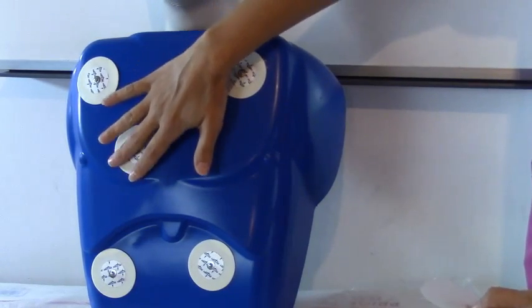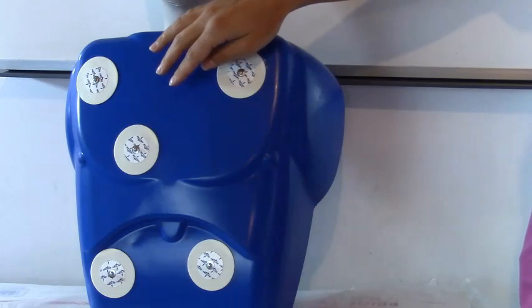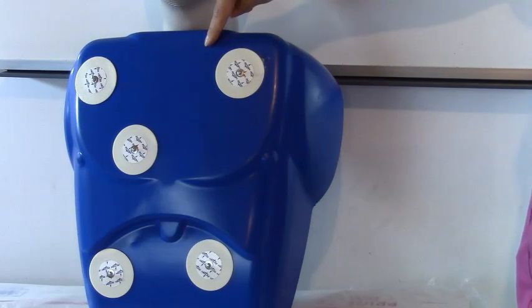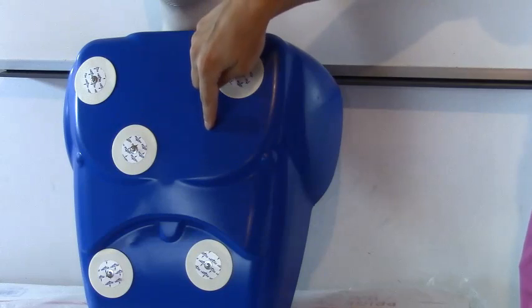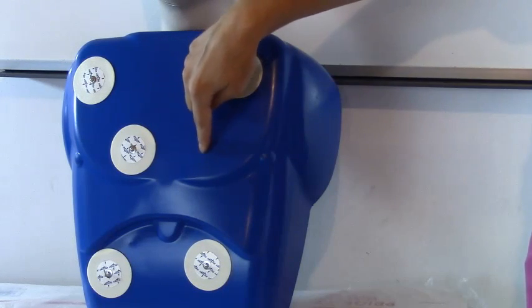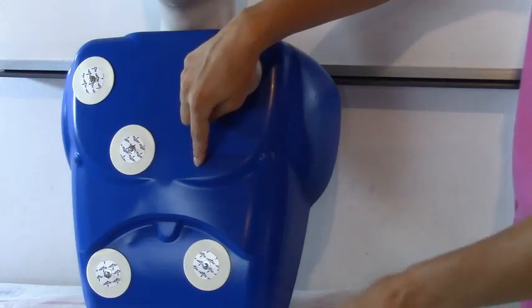Now let's place V2. We're going to go left to the sternum and we're going to go to the fourth intercostal space and it should be right beside over to the left of where V1 is so V2 will be right here.